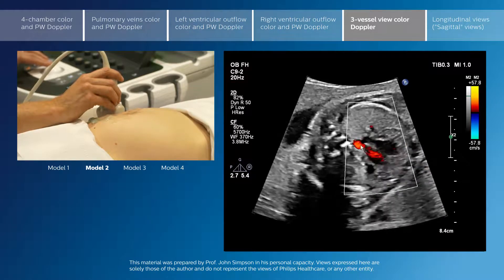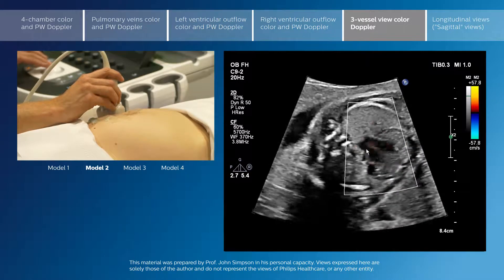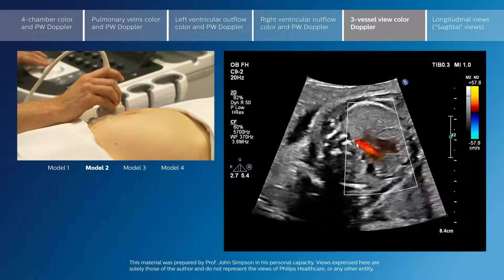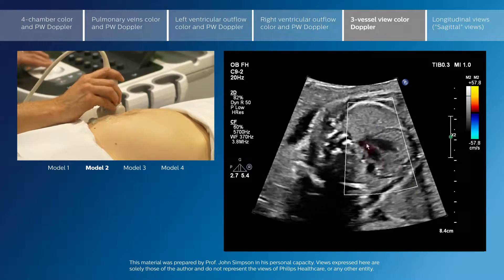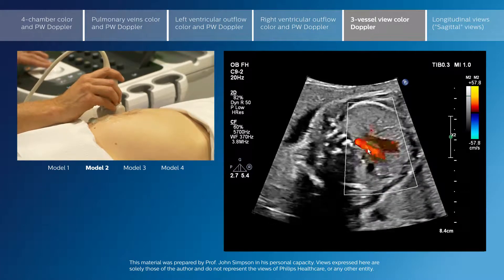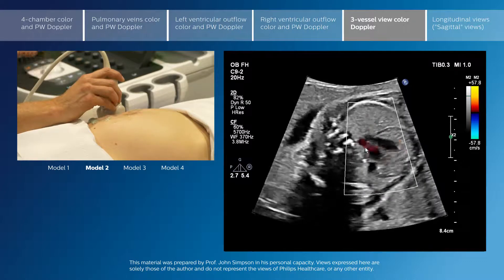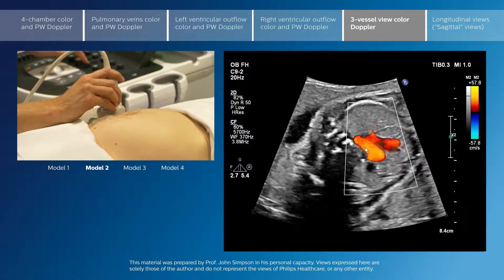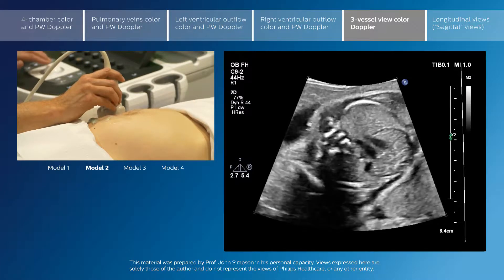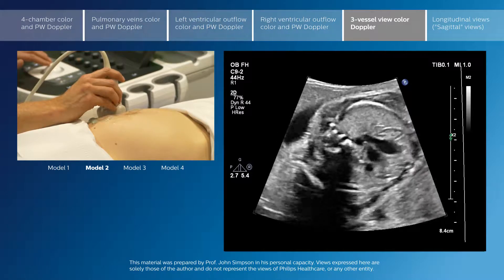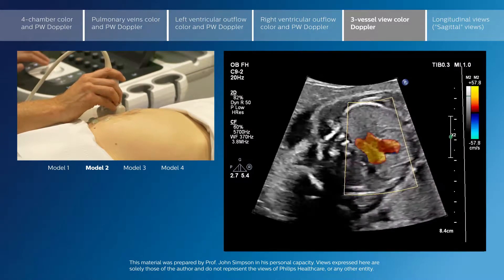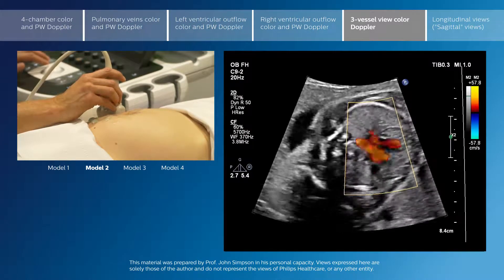These arteries should have the same colour flow — the flow should be going in the same direction. Any major asymmetry in the size of the vessels or difference in their colour flow direction can indicate an underlying cardiac defect.